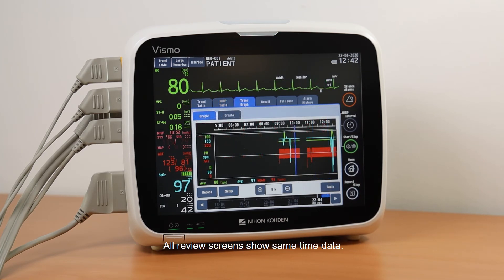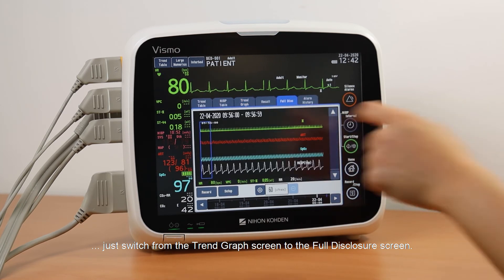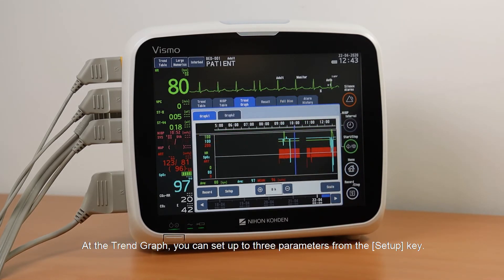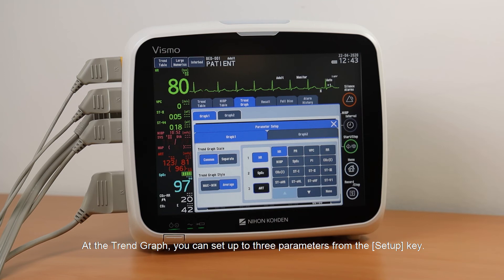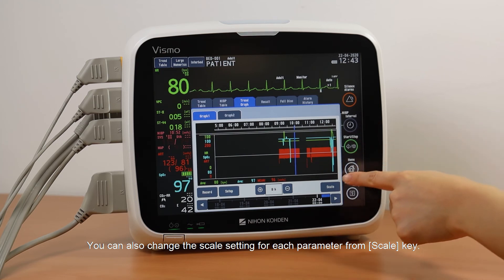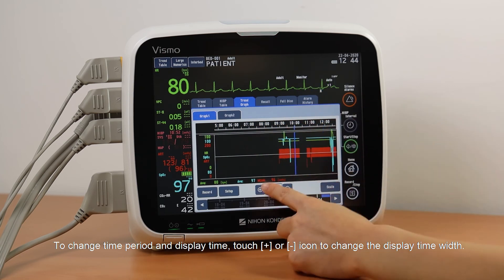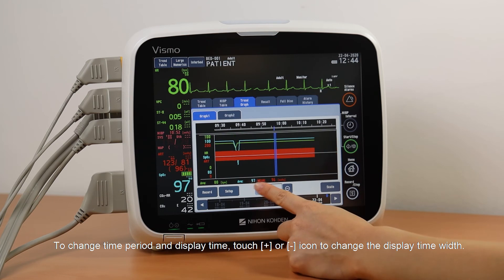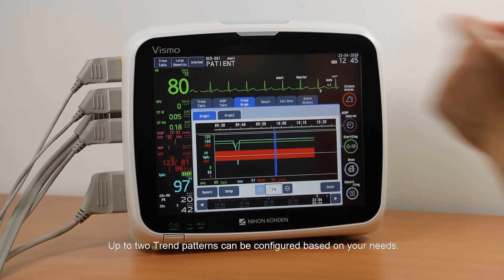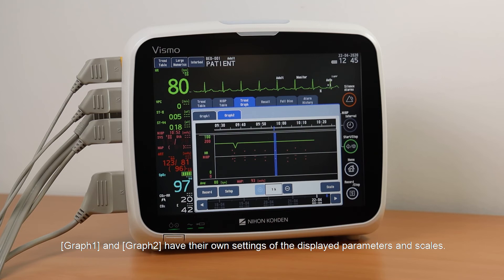All the review screens show the same time data. To review waveform data at any specific time on the Trend Graph, just switch from the Trend Graph screen to the Full Disclosure screen. At the Trend Graph, you can set up to three parameters from the Setup key. You can also change the scale setting for each parameter from the Scale key. Touch the plus or minus icons to change the display time width. Up to two trend patterns can be configured based on your own needs; Graph 1 and Graph 2 have their own settings for displayed parameters and scales.